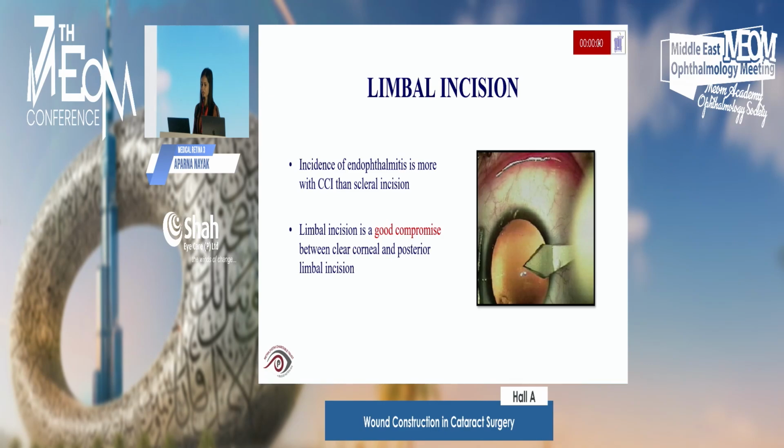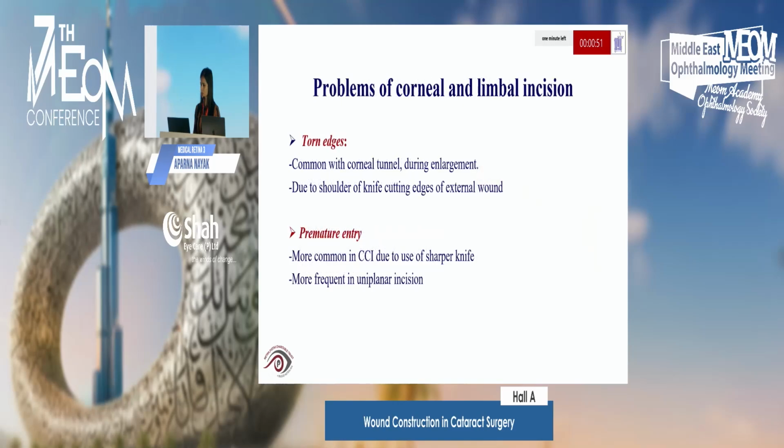Yeah, limbal incision is a good compromise between the clear corneal and the posterior limbal incision. And sorry, the slides are not moving. It's okay. You can continue. Moving. Okay. So there are some issues with the clear corneal and limbal incision.